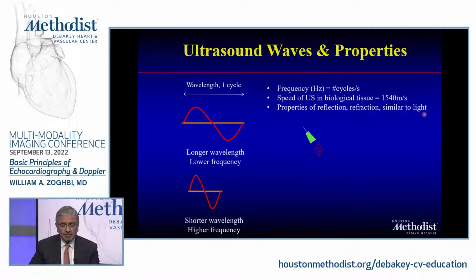So basically the ultrasound transducer has crystals at the tip of it. They are called piezoelectric crystals because if you excite them either mechanically or with electricity, they will deform. And with that deformation, after they stop deforming, they will emit a certain frequency, and that frequency can be modulated to be fast or short.